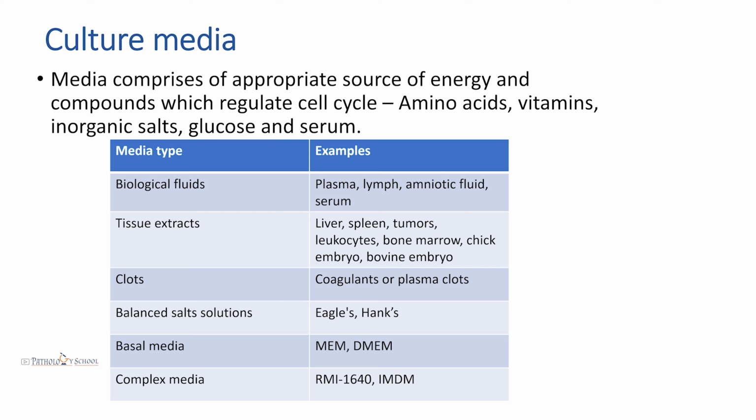So if we do not want the cell to become differentiated and we want them to proliferate even more, these growth factors present in the serum inhibit it. So then they decided to produce a serum-free media, and this media was made by specific labs, and each lab has its own set of serum-free media which are complex media.